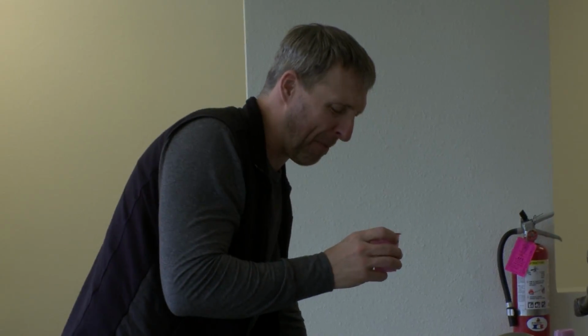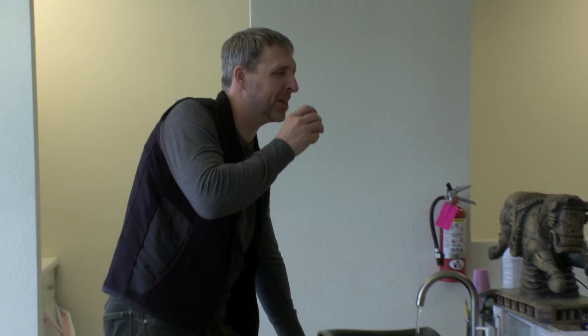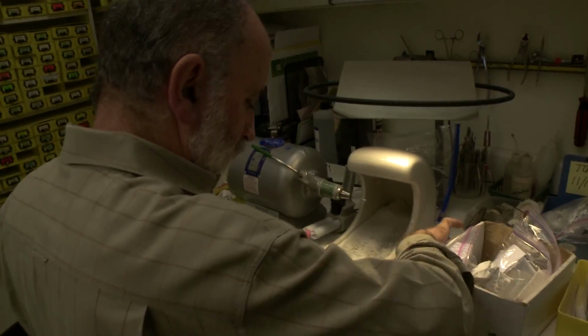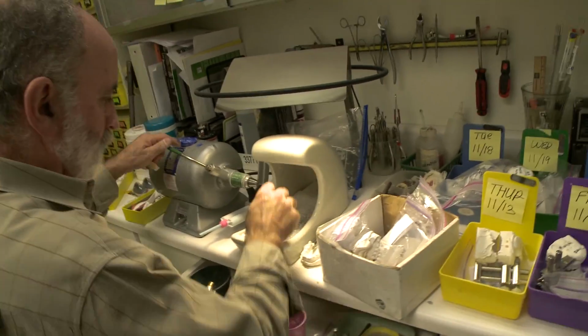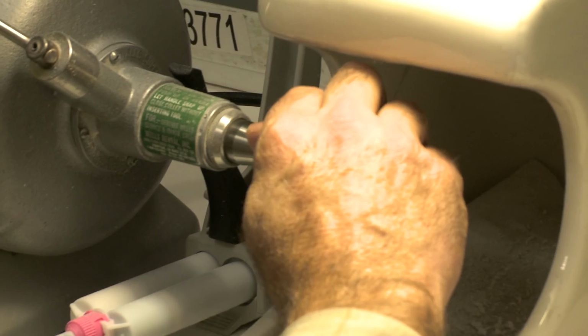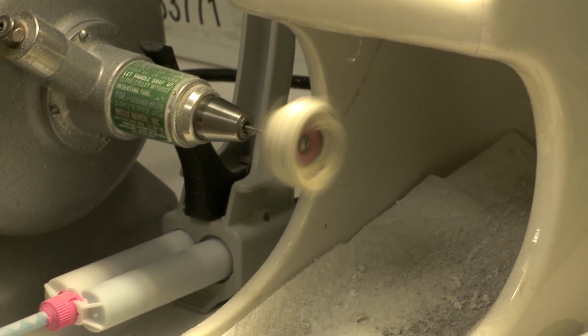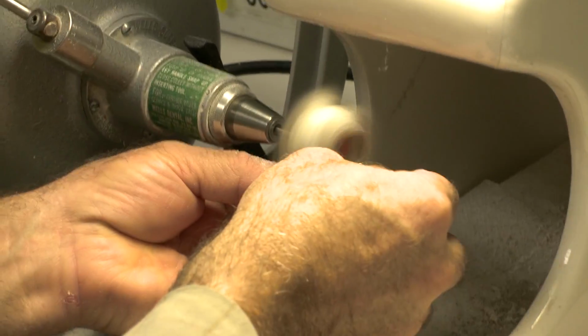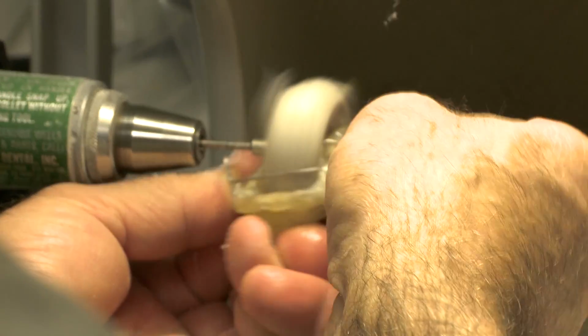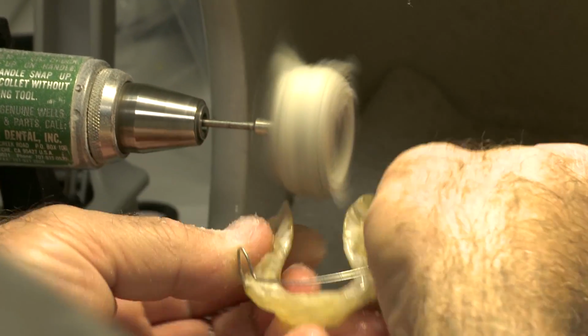Stuff smells like paint thinner and epoxy mix. It's gross. Yeah, we trim this down with burrs and then we have to polish it where the repair was made.